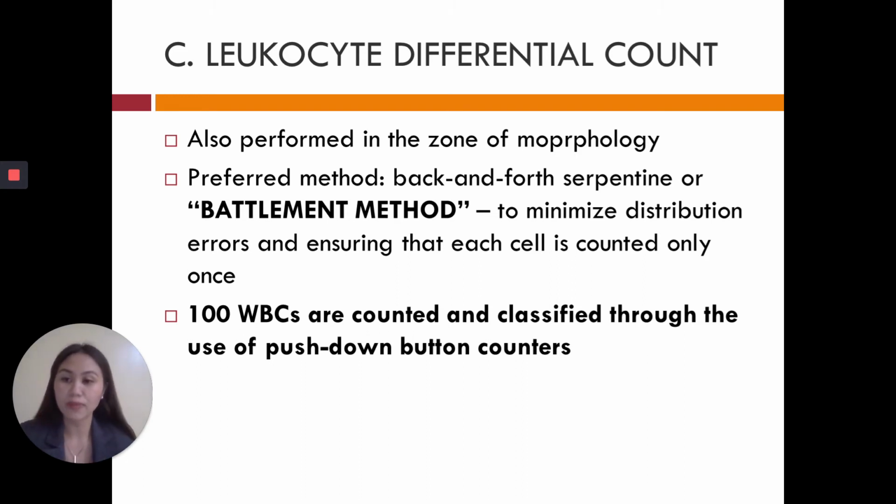And how many are basophils? So that's how you do your leukocyte differential count. Again, you need to identify 100 WBCs. As soon as you're done identifying them, you're halfway through the procedure of the leukocyte differential count.